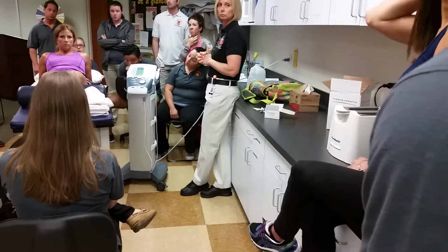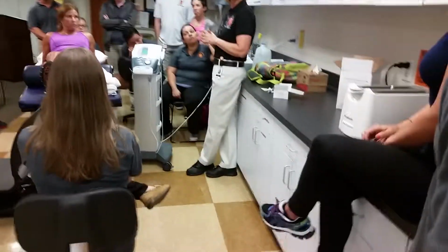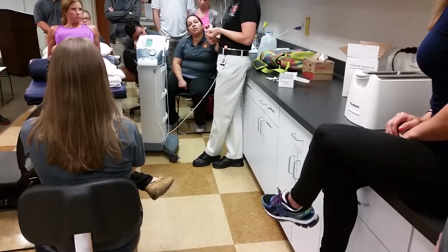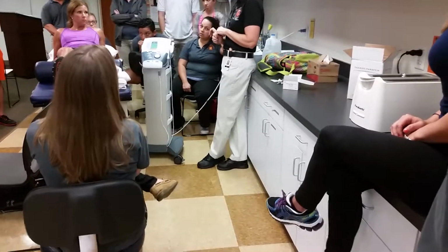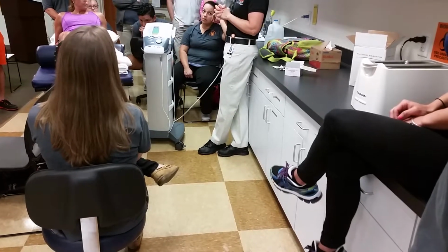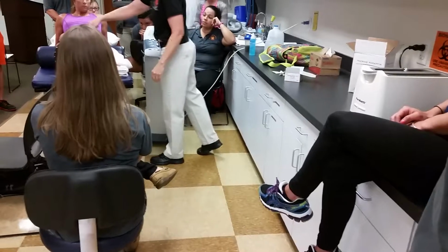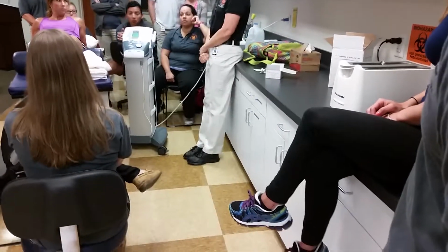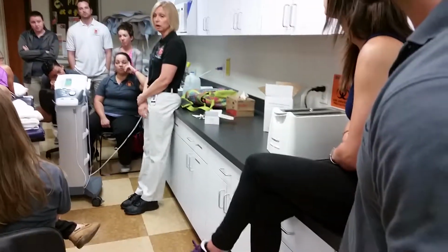And then I guess the location, if she was younger, the epiphyseal plate. If she were younger, I'd be worried about growth plates, blood clots, and metal in the area, cancer in the area. Not so much for her, for plastic or prostheses, but believe it or not, they're really doing joint replacements in younger and younger people these days. So if you see a scar over the center or around the side, you need to ask, okay? Because they could very well have had some kind of joint replacement.